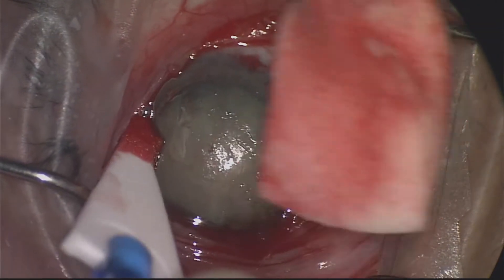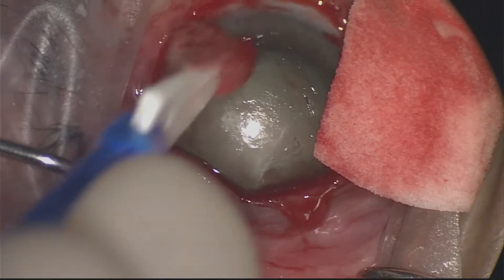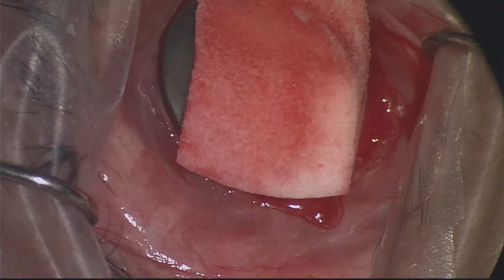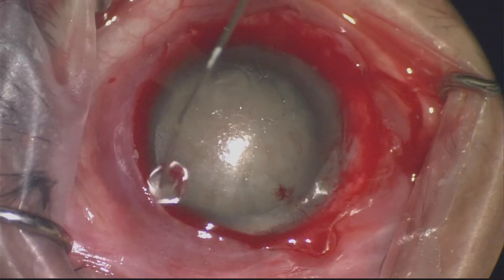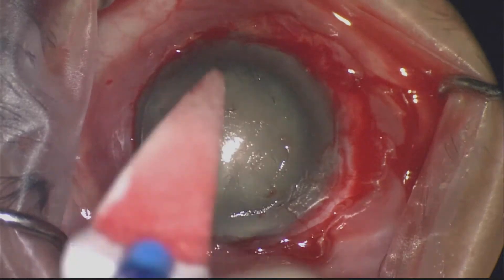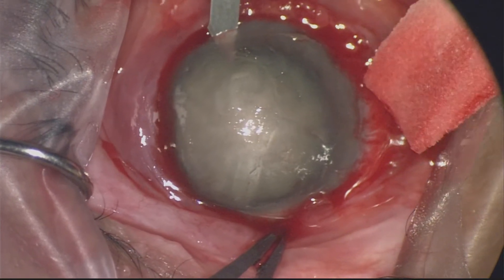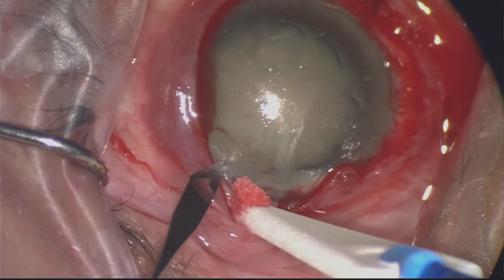Here I'm just drying the limbal area and checking there's no residual scarring. You want to take as much scarring away from the limbal area as possible in preparation for cataract surgery and later for amniotic membrane transplantation. I'm putting some more drops of adrenaline on the surface and assessing the view — when you compare this view now to before, it's a big difference, and it'll get even better later when we use ocular surface protection.